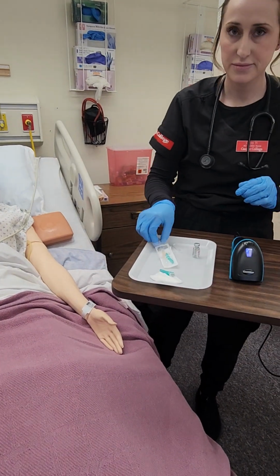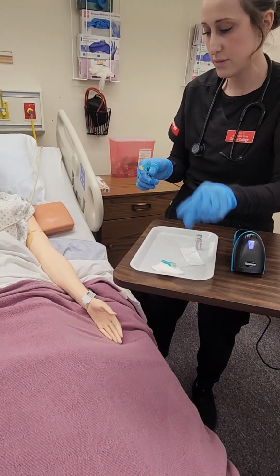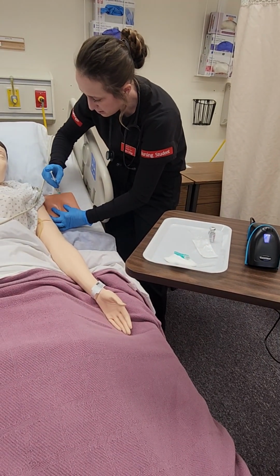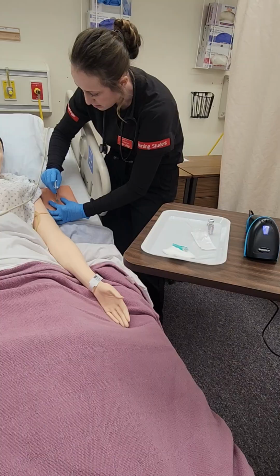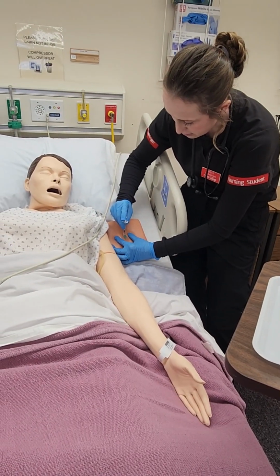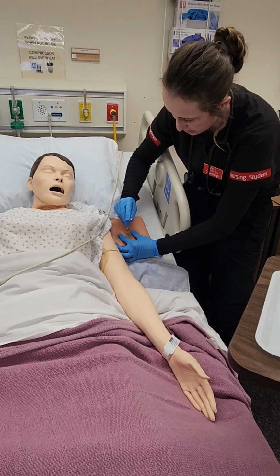That's full. Okay. All right, I'm going to pinch the fatty area, insert at 90 degrees in a darting motion, and inject slowly. Then I'm going to hold it there for 10 seconds.